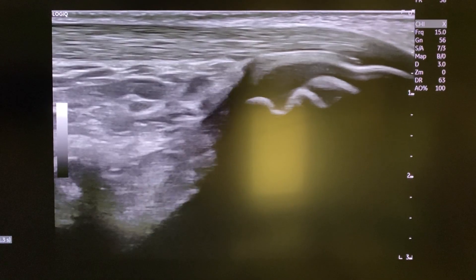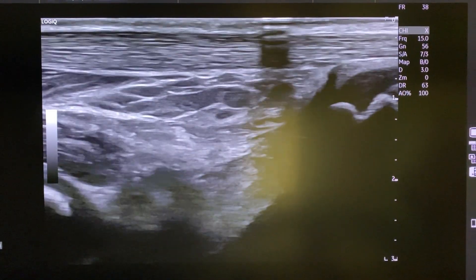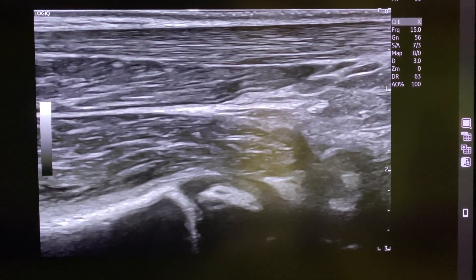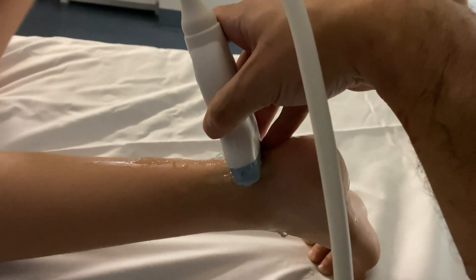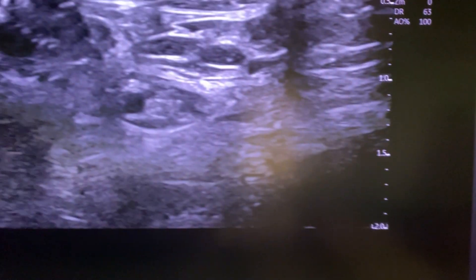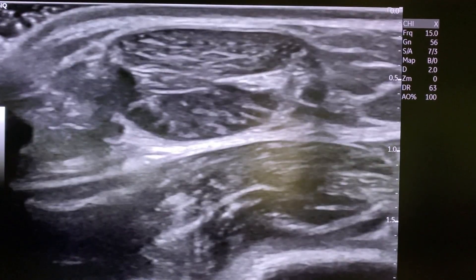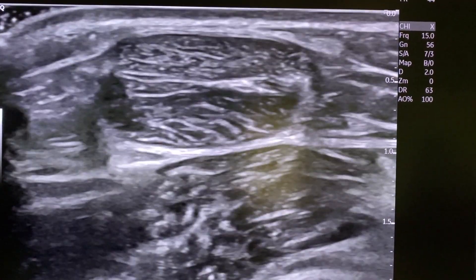I then begin to scan superiorly, usually focusing on the tendon and surrounding soft tissues, looking for fluid, edema, or inflammatory changes. Then I scan transversely, going up the tendon, also focusing on just the tendon and the soft tissues, including the calf muscles if there's concern for a tear of a muscle or any type of muscular injury.